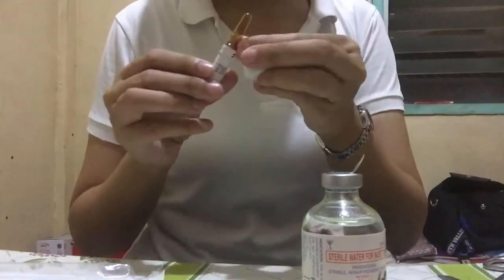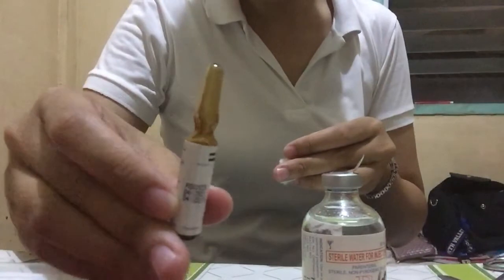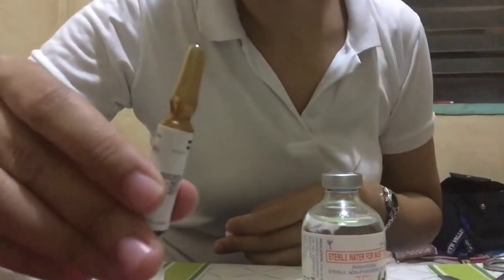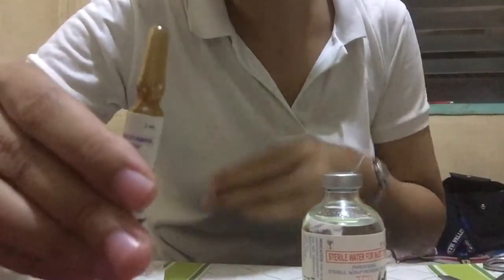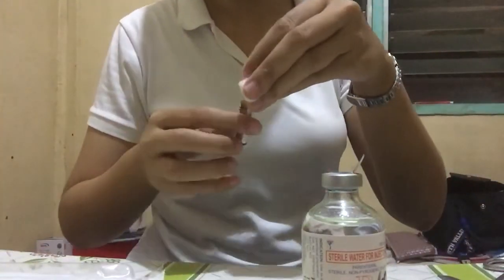Then, looking at the ampule — it has a dot, right? So the dot should be facing you.